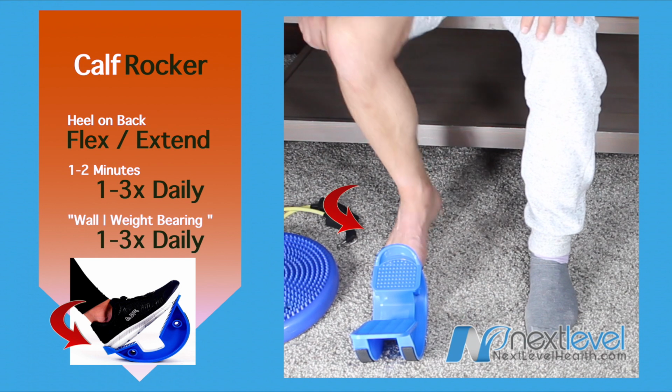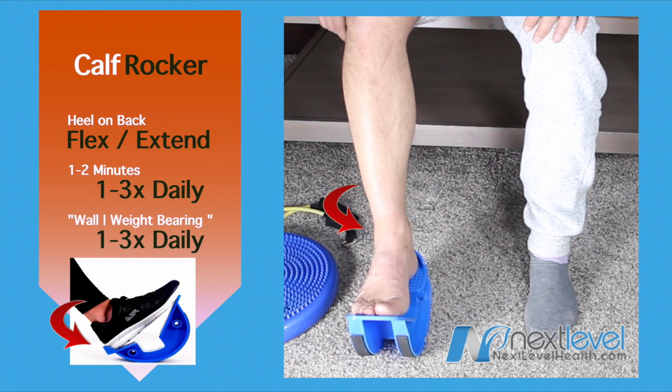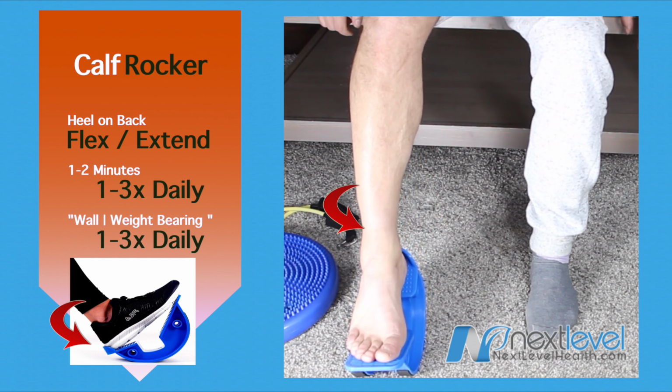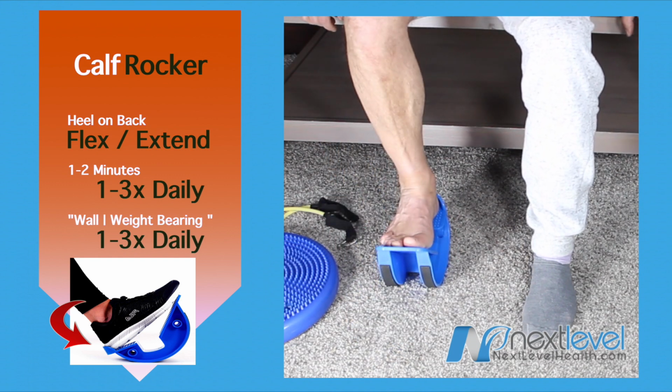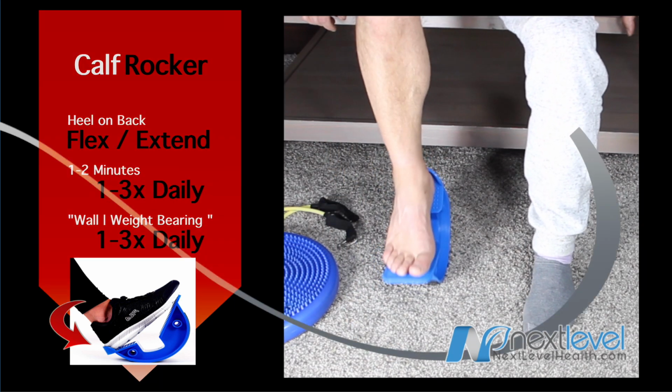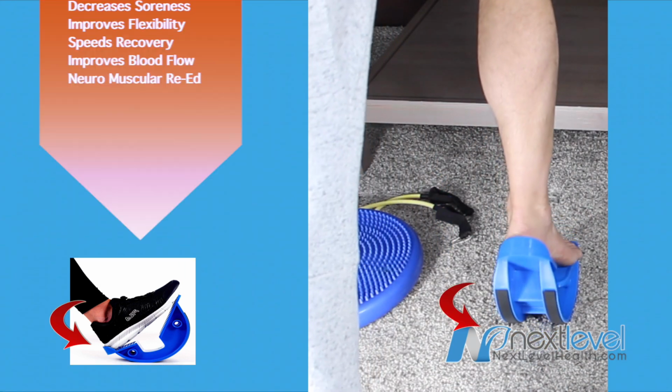Hey guys, if you've been given one of these calf rockers, there's probably a particular reason for that, and here's how you're going to do it. Just notice on the back side of the calf rocker, that little lip, that little edge, that's where your heel is going to go.